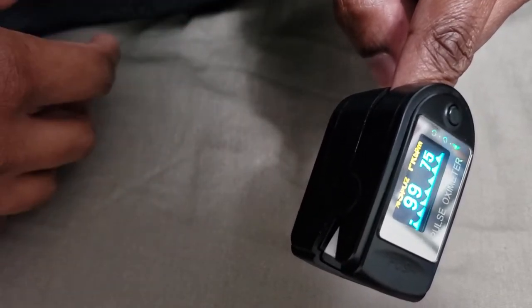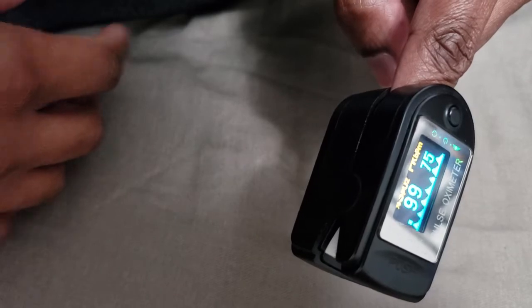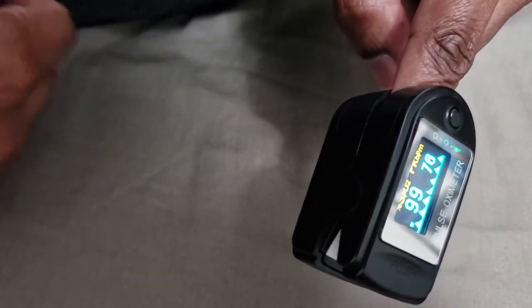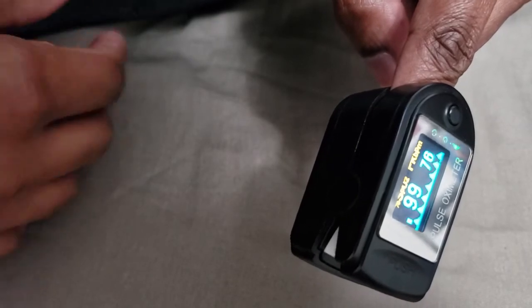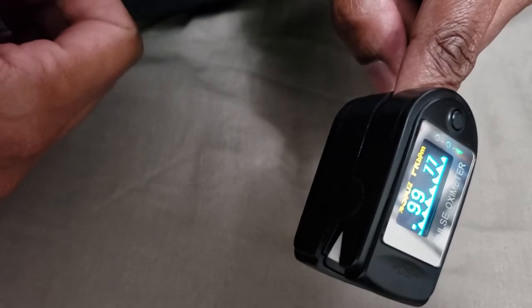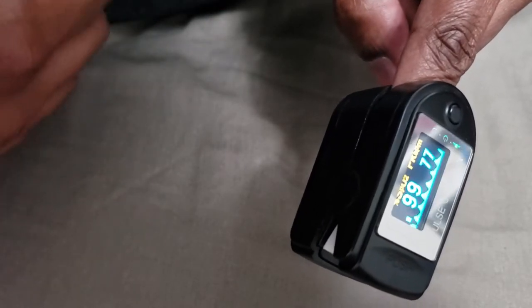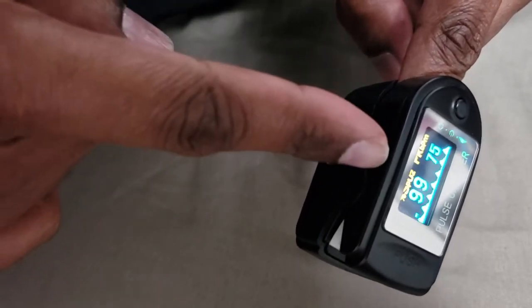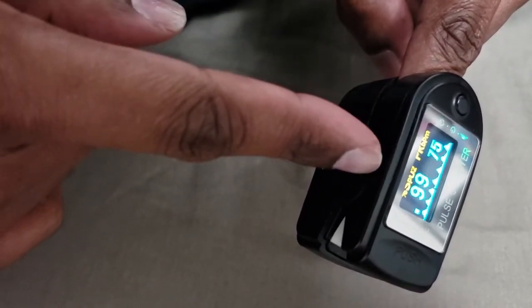Or maybe I see 96 and I would see, that's strange because I'm usually 99. Why would it say 96? For me, I can tell you as an asthmatic, if I see 96, I'm probably feeling sick. All right. Some people, they might not even notice it. All right. So that is the difference. So right now it's 99.